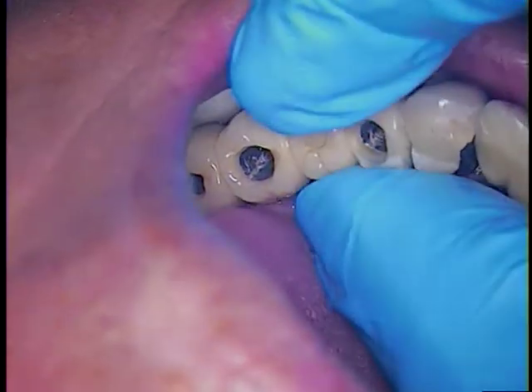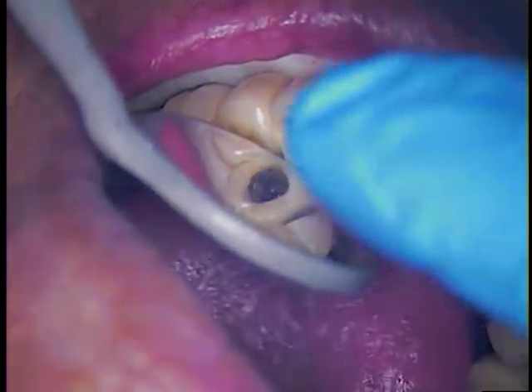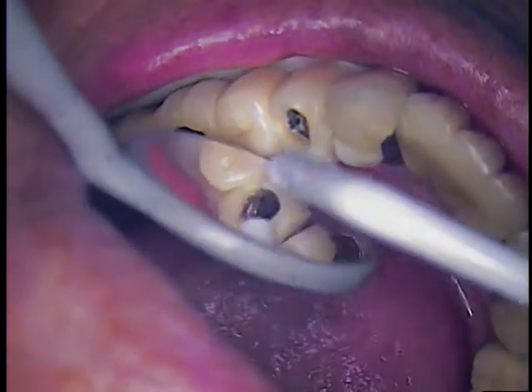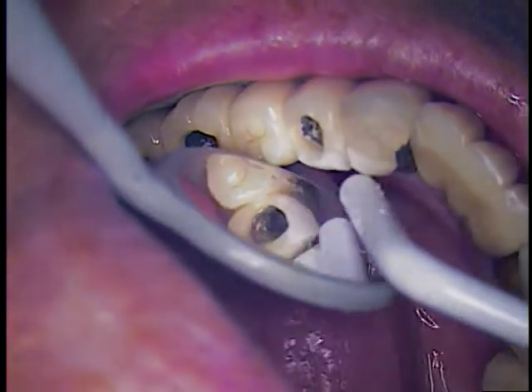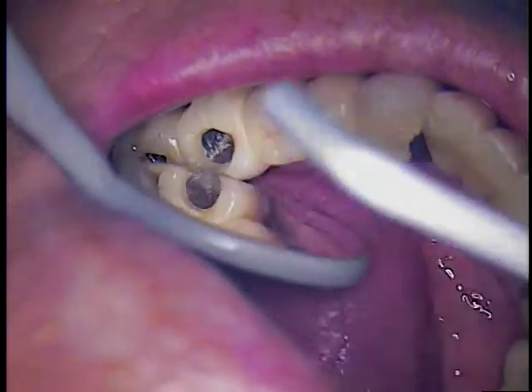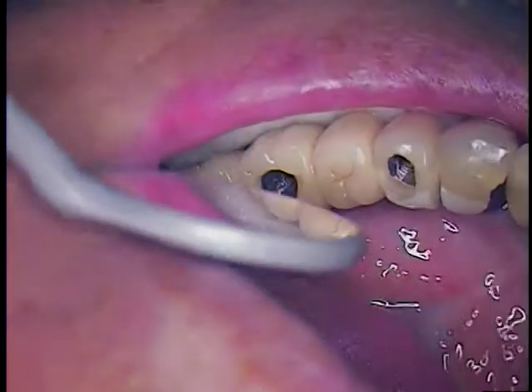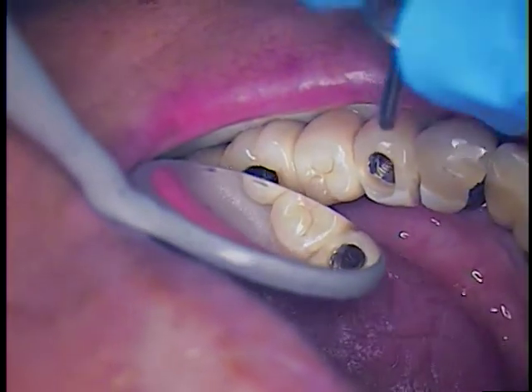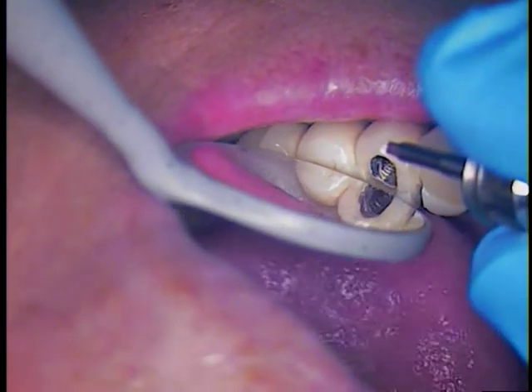Let's see how I put them down — and of course now the looseness is back. So that screw is a pain. That's an angled screw, and because it's like that, it has to be loosened completely. So further efforts on this screw. Once this screw is out, then the whole bridge will pop right out — no problem. The problem is you've got one on an angle, and we can't put a driver on it; the driver's going this way.